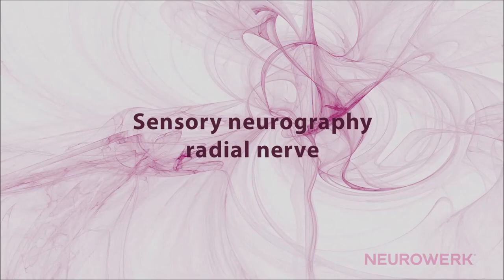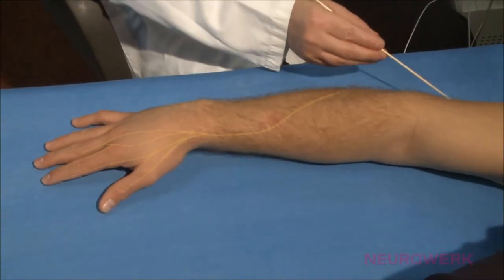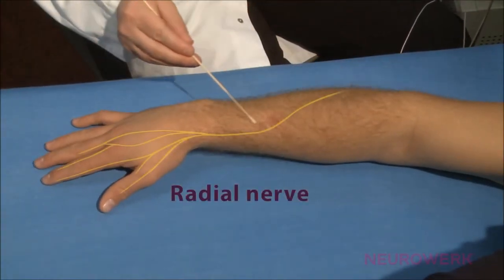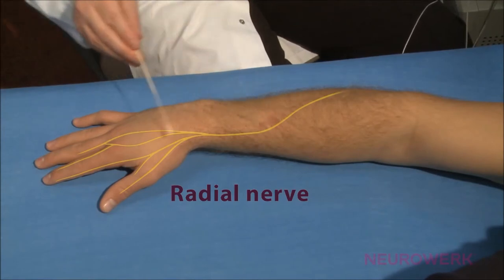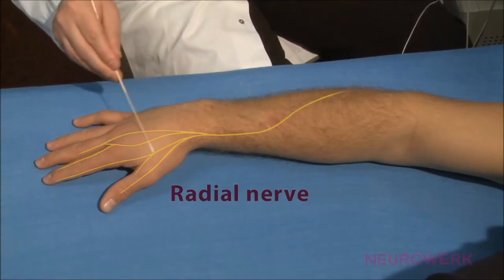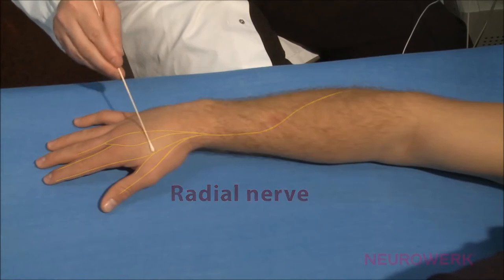Sensory neurography of the radial nerve. The measurement of the sensory nerve conduction velocity on the radial nerve is shown here in the antidromic technique. A recording in the orthodromic technique is also possible.